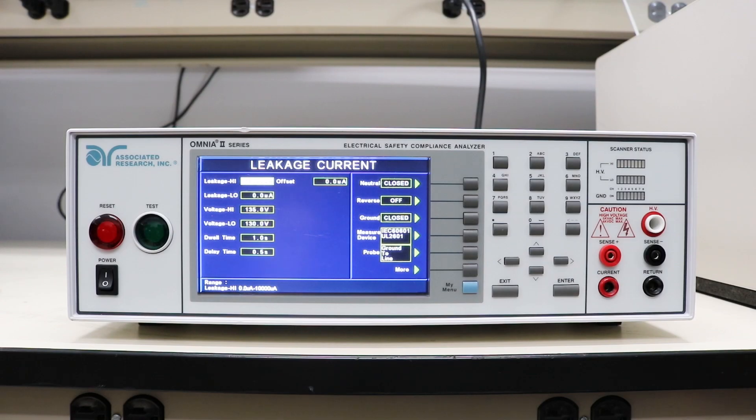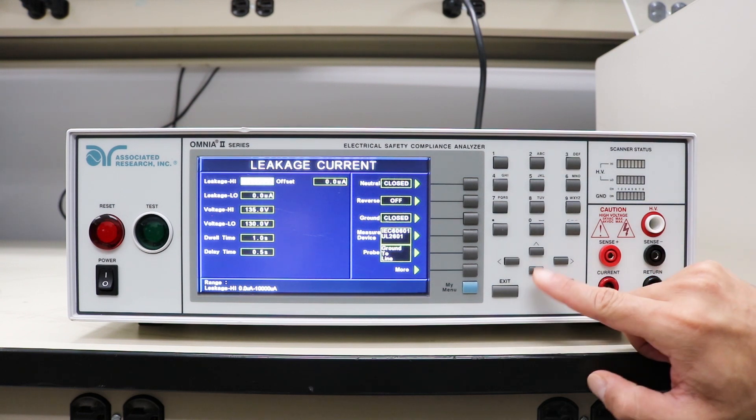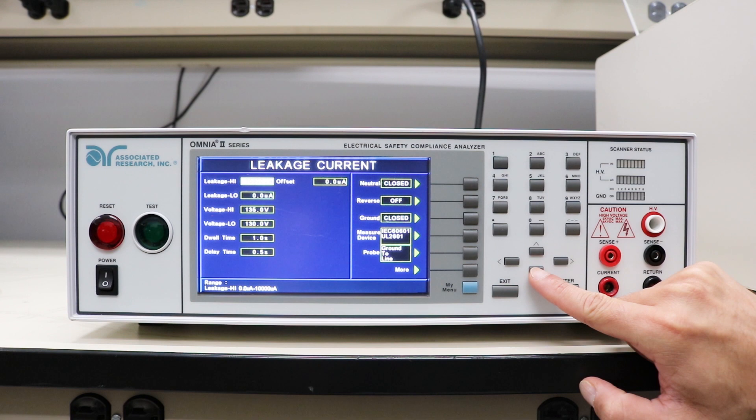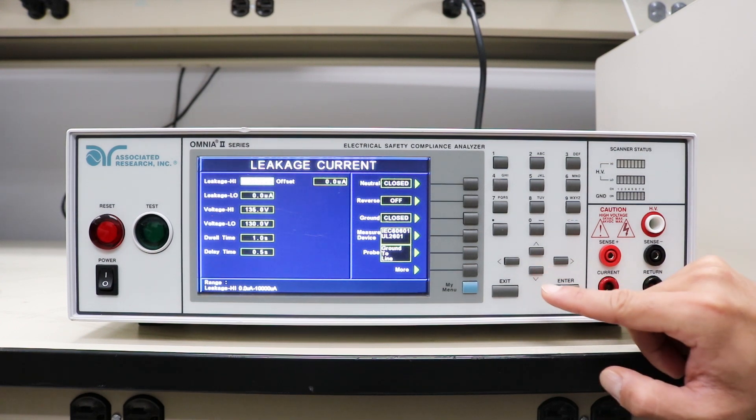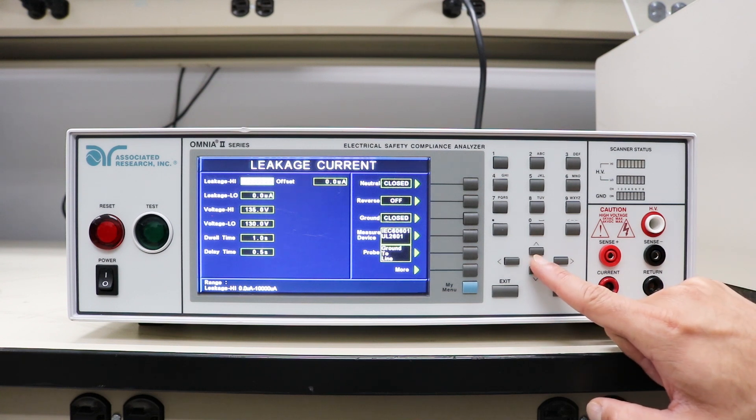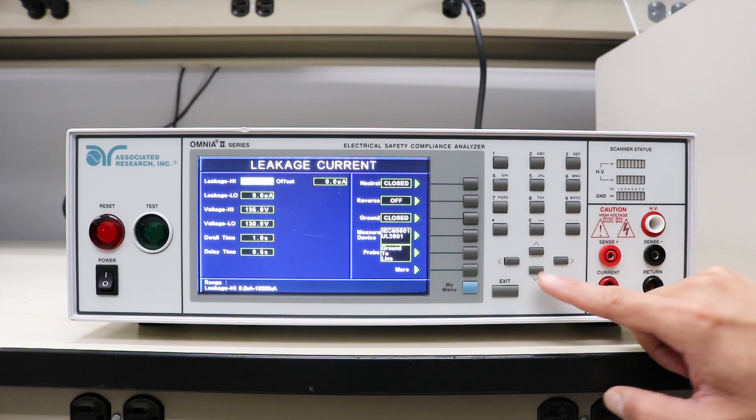We're going to go over the test parameters that we need to program before we can actually perform the earth leakage tests. Starting with the first test parameter, leakage high. This is the maximum allowable leakage current per the test standard. Since we're testing according to the IEC 60601-1, the high limit for the leakage current is 10 milliamps for single fault conditions and 5 milliamps for normal conditions. We're going to leave that at 10,000 microamps, which is the same as 10 milliamps.